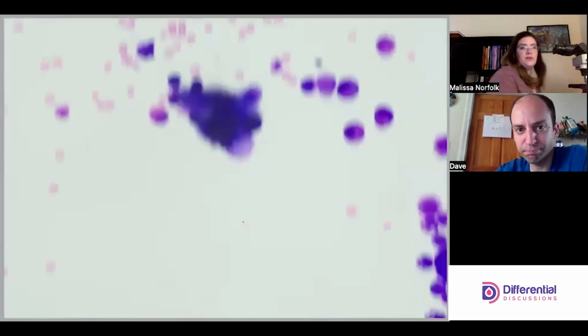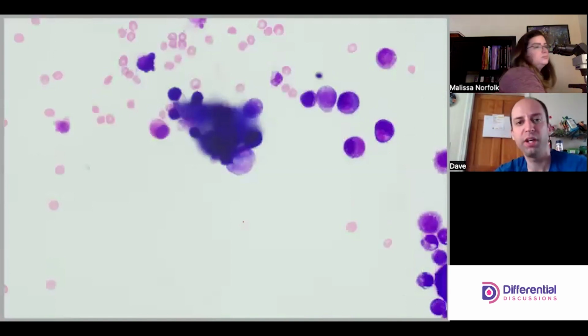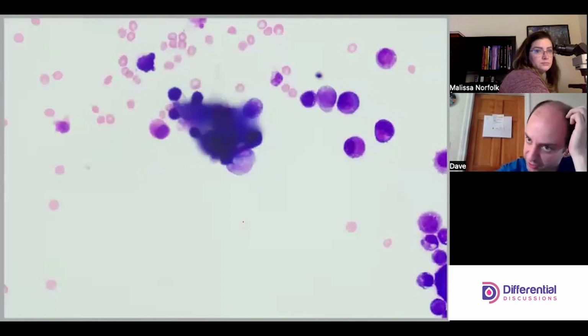This little cluster right here is a pretty perfect example, right? We can see there's nuclei in there, and we can see that there's cells, and that there's a height and a depth to it. We can also see around here that the cytospin has successfully smushed the cells down to the glass. So yeah, this is highly suggestive of a tumor.